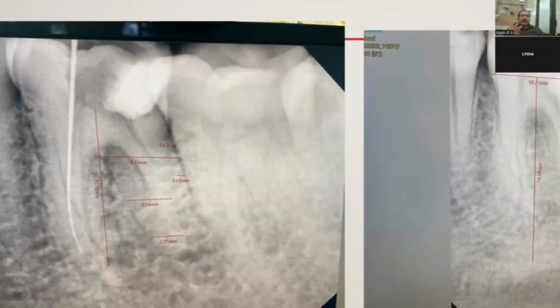Understood? So here what we are planning to do is place an implant of 3.3 millimeter diameter in an area having a span of 6 millimeters. So it has to be exactly in the center. It has to go exactly in the center downwards, cross the infected site of the apex and get fixed in a portion still apically. So how much is the root length now?